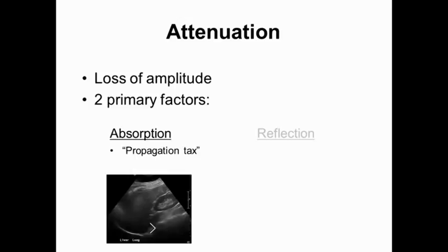substance. This image shows decreasing intensity of returning waves as they are reflected back from deeper in the tissue. The liver tissue at the bottom of the screen is not any less echogenic, but it appears darker because the waves have lost amplitude propagating through all of the above liver tissue. The amount of absorption is variable and is influenced by the type of tissue encountered and the frequency of the wave. As mentioned before, lower frequencies have better penetration into tissues. One of the reasons for this is that they suffer less absorption when propagating through tissues and therefore are able to return brighter images from deeper structures.